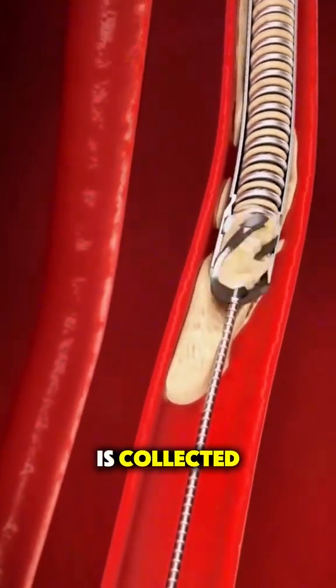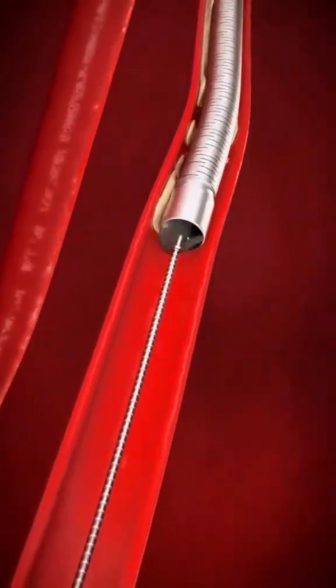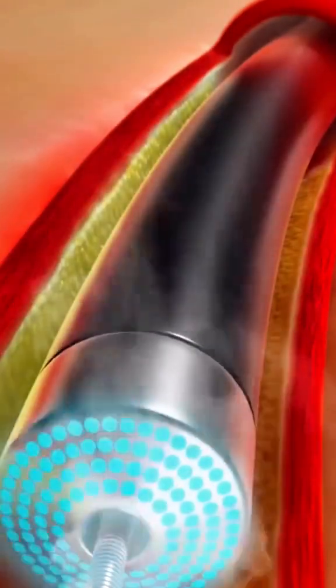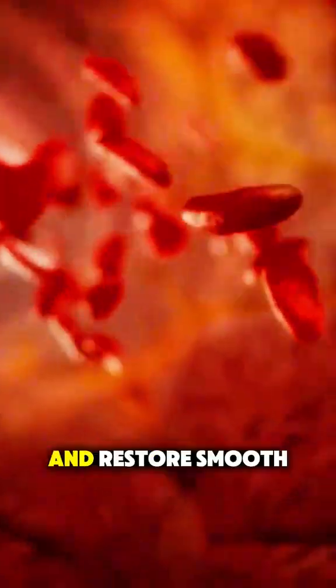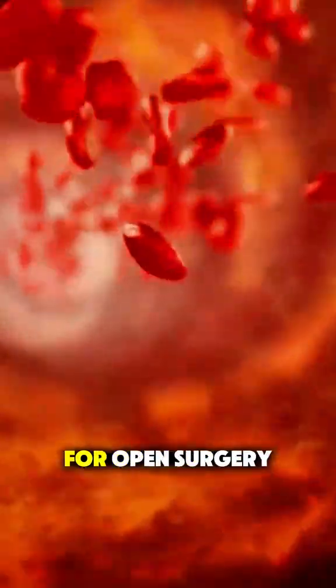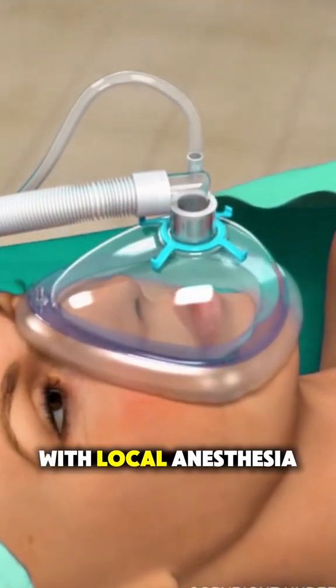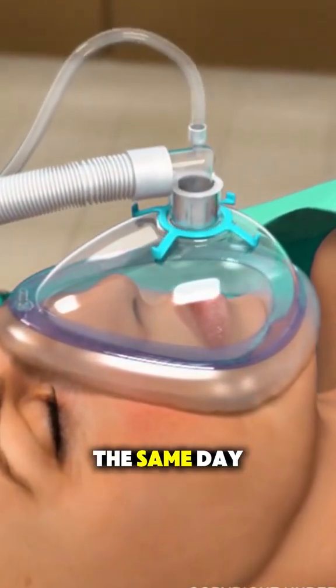Sometimes the plaque is collected and removed through the catheter. Other times, it's broken down and absorbed by the body. The goal is to clear the blockage and restore smooth blood flow without the need for open surgery. Most people are awake during the procedure with local anesthesia and go home the same day.